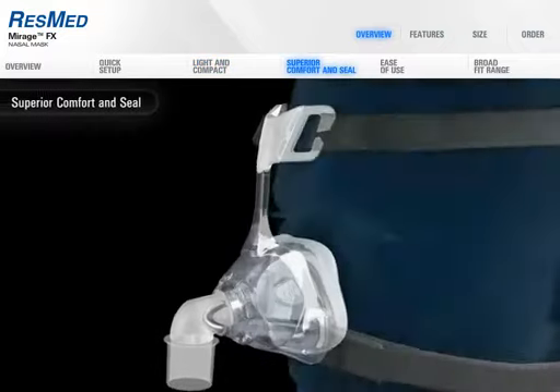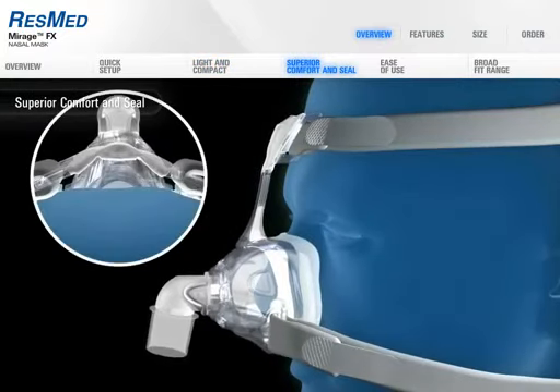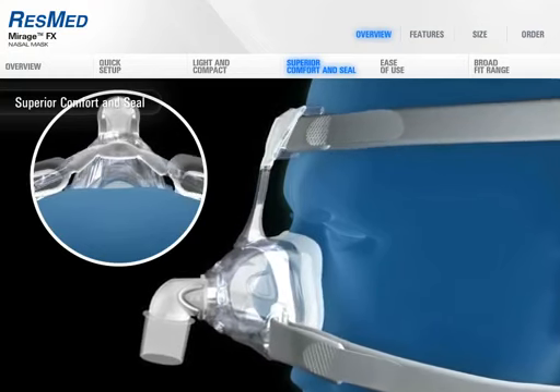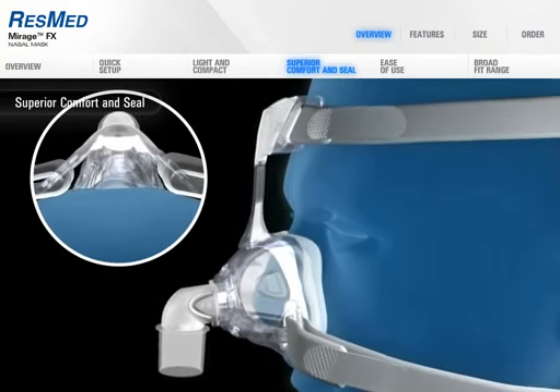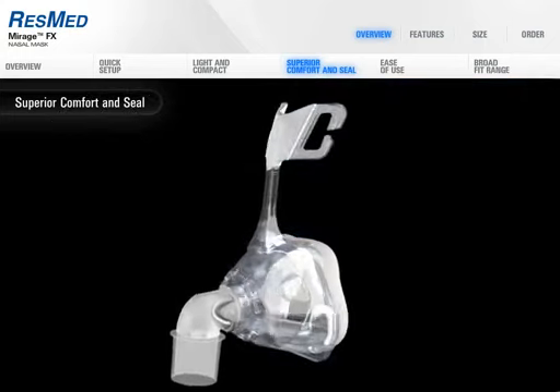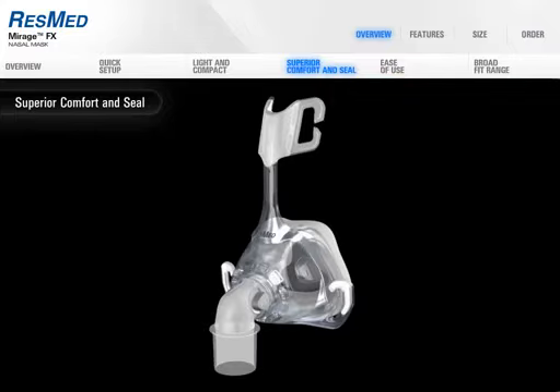Mirage FX's dual wall spring air cushion provides even pressure distribution with extra softness at the nasal bridge. The winged forehead support provides both stability and flexibility and ensures that only the headgear fabric, not the frame, comes into contact with the face.